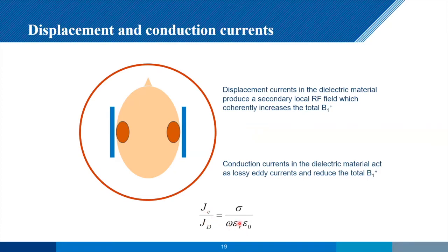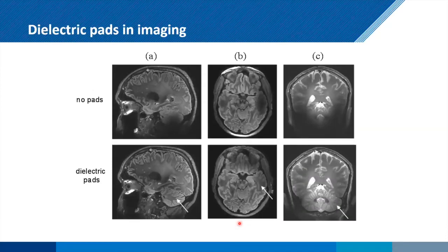And we also want to have high permittivity in terms of the material. And so by using this gives us a pretty easy, pretty cheap, very practical solution, let's say, to some of the signal dropouts in neuroimaging over here. Now, of course, for about the first 3-4 years, this is what we did. And everybody was scanned with this.